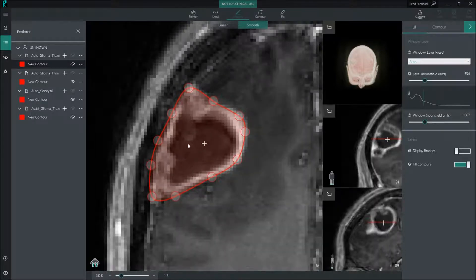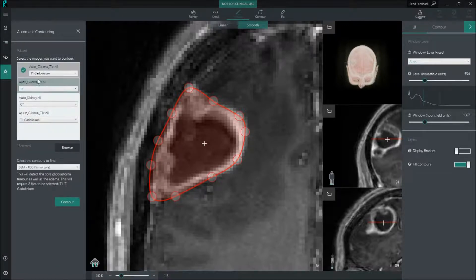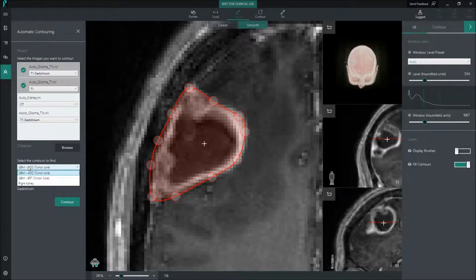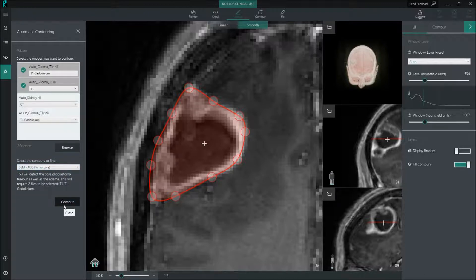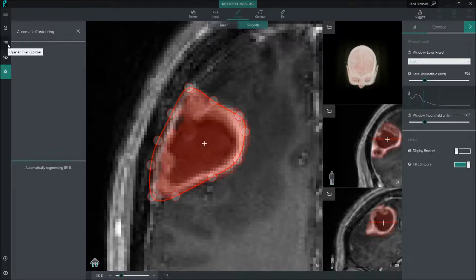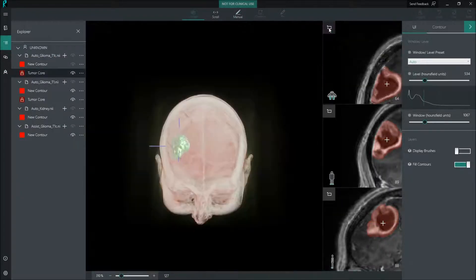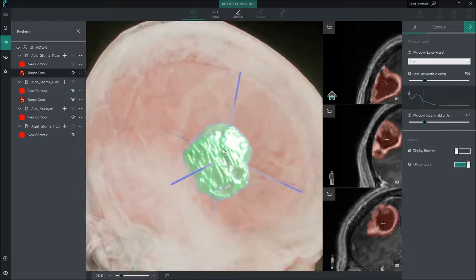Our AI algorithms can help here by doing the whole 3D segmentation completely automatically. I am selecting the patient images and then choosing a machine learning algorithm that has been pre-trained to recognise and segment this type of tumour on many similar images of past patients. The machine learning model we use here is a decision forest, which classifies each voxel in the image as belonging to the tumour or to the healthy tissue. Here is the automatically obtained 3D segmentation.